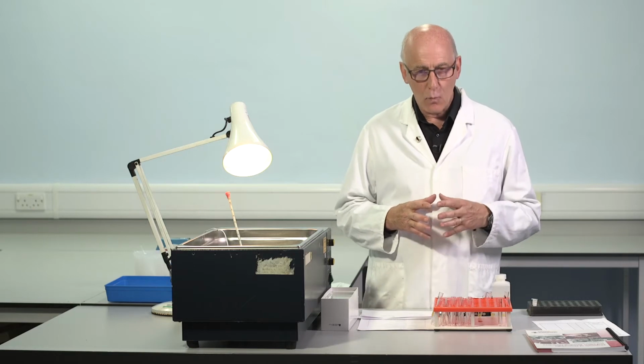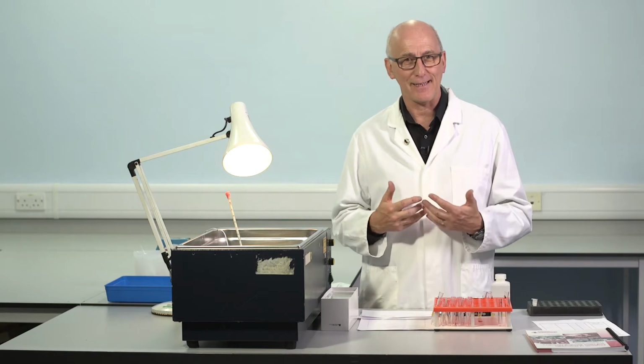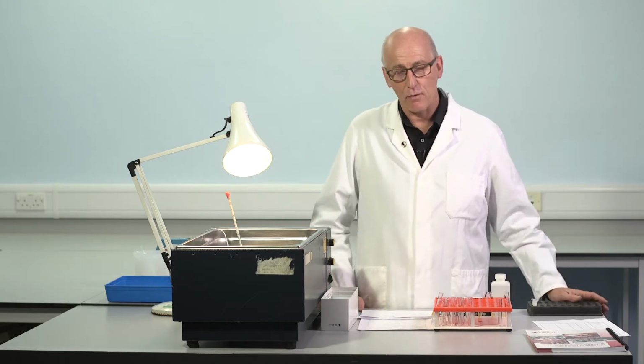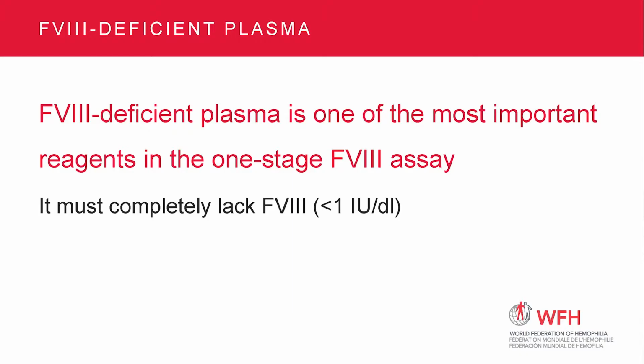It means that one of the most important reagents in our one-stage factor VIII assay is the factor VIII deficient plasma. It's absolutely key, and there are a number of important features, and again these are described in the WFH laboratory manual. Well, the first and most important feature, it must completely lack factor VIII, so the level should be less than 1 international unit per deciliter. And for many years the most commonly used source of factor VIII deficient plasma was donations from patients with severe haemophilia. And this works very well.